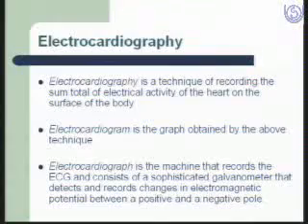So today we will be covering electrocardiography from basics to clinical practice. The first slide: what's the definition? Let's define a few terms first. Electrocardiography is a technique of recording the sum total of electrical activity of the heart on the surface of the body. Whereas the electrocardiogram is the graph obtained by the above technique, which is commonly known as the ECG, and the machine which records this ECG is known as the electrocardiograph.